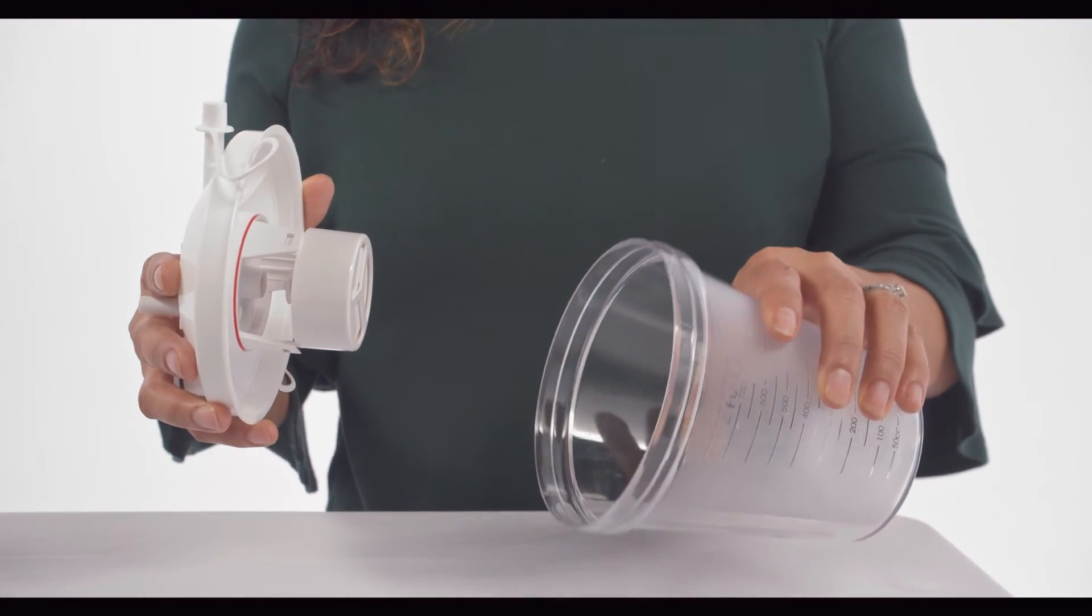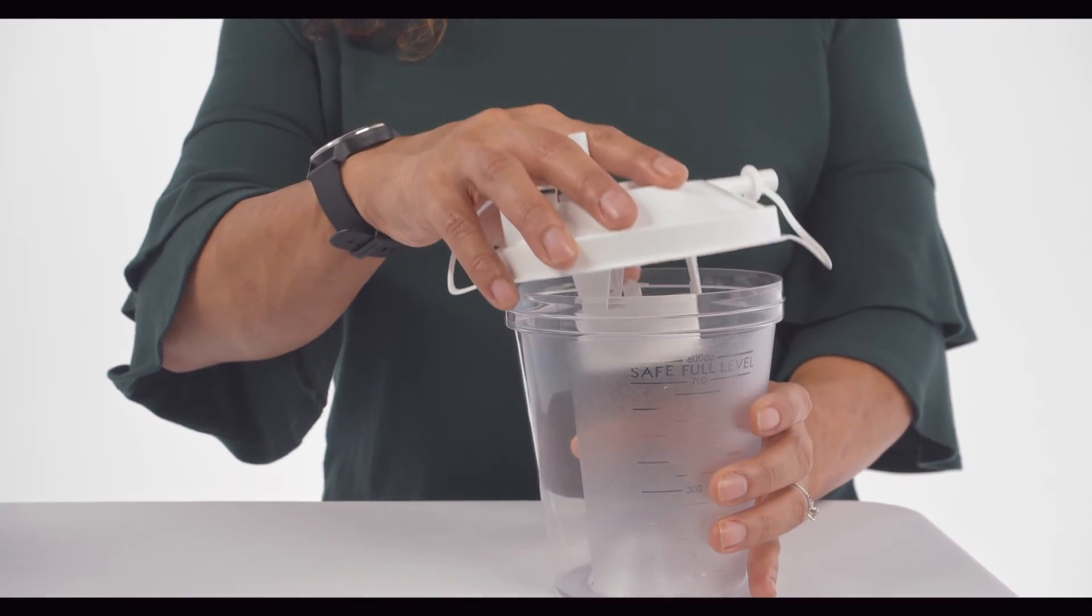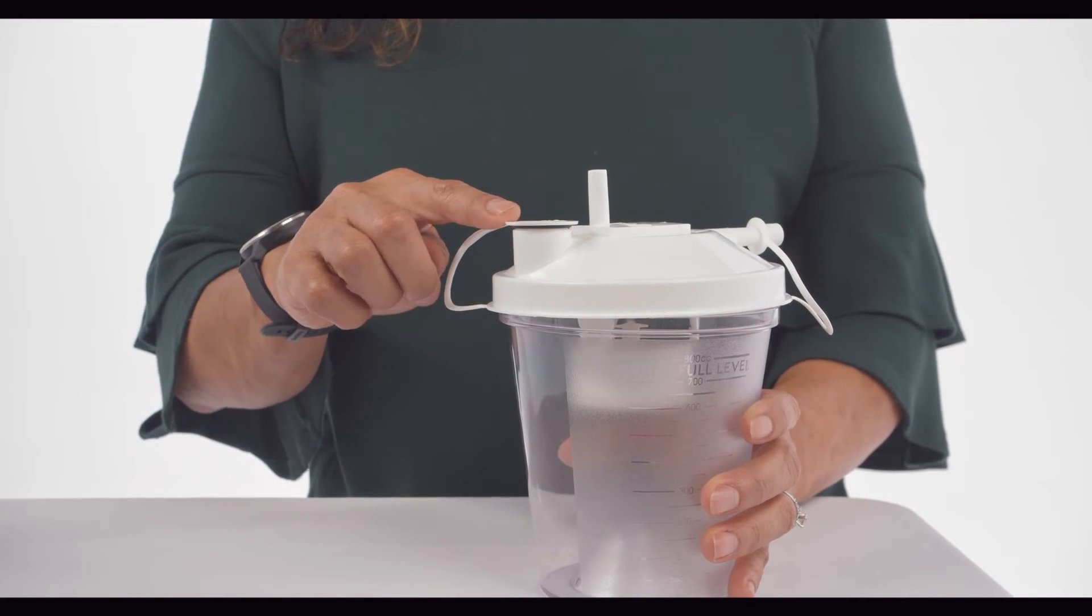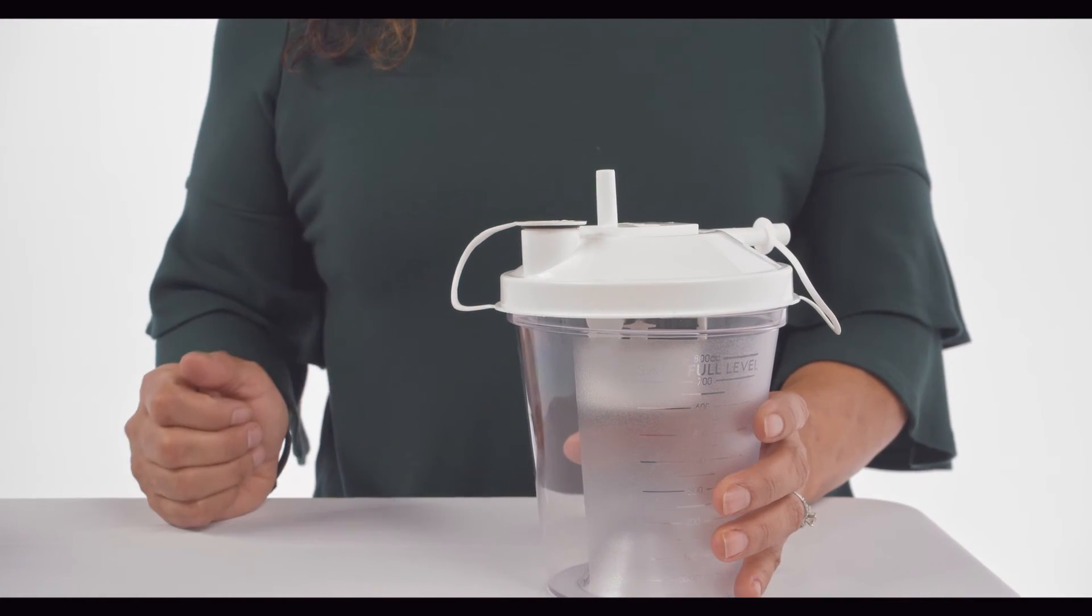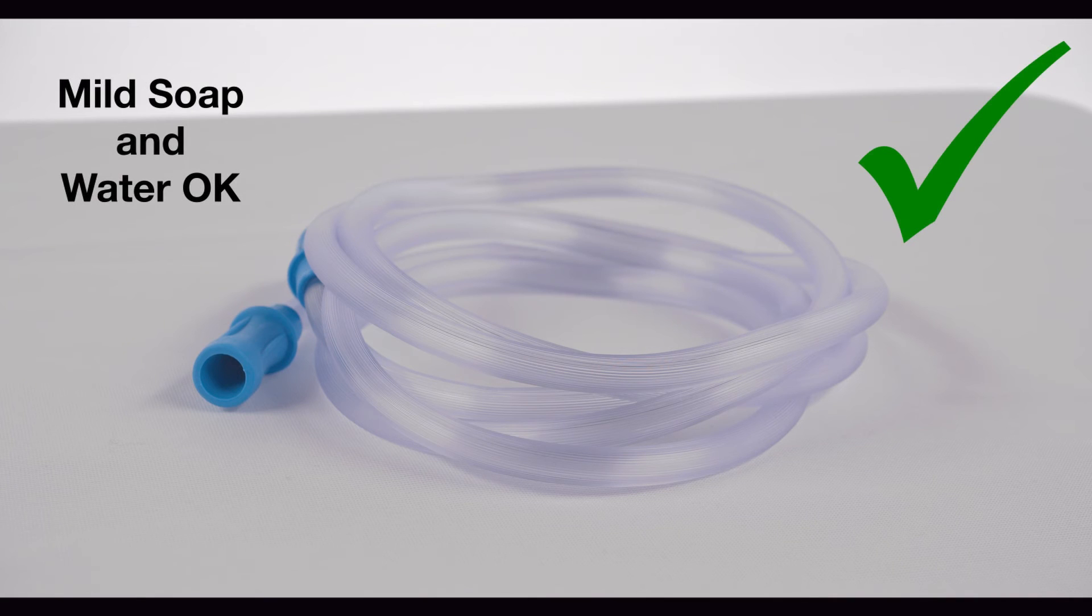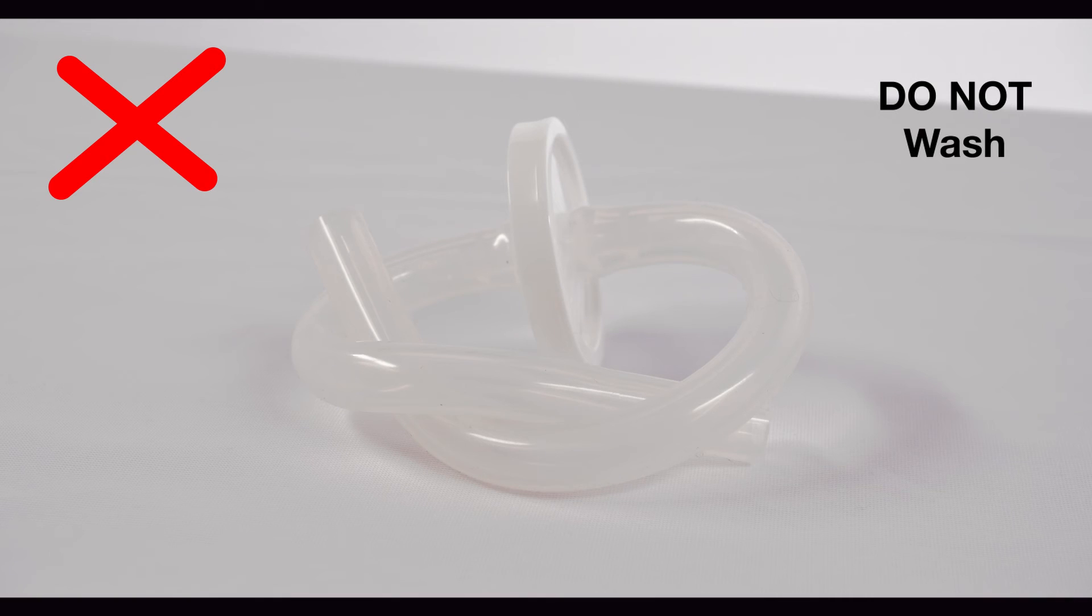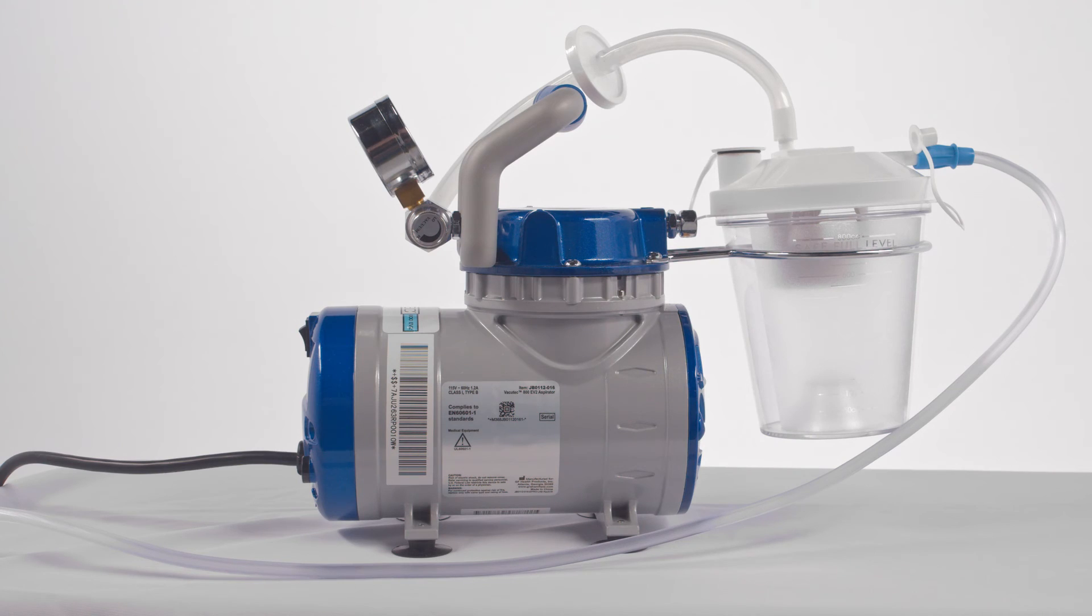Make sure to properly empty the collection bottle by removing the entire lid and not pouring secretions out of the hole at the top. Wash the bottle with mild soap and water. Your patient suction tubing can also be washed with mild soap and water. The unit tubing with HEPA filter should not be washed. Always follow the guidelines and instructions provided by your healthcare professional.